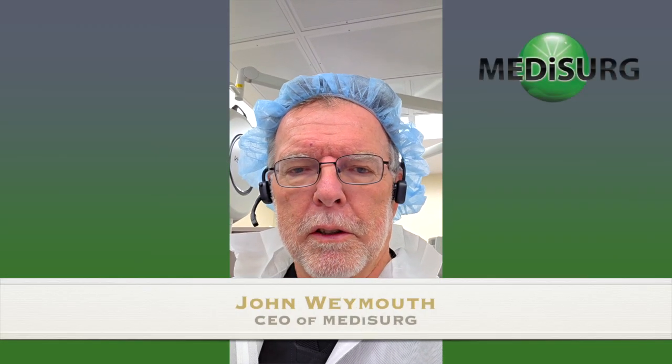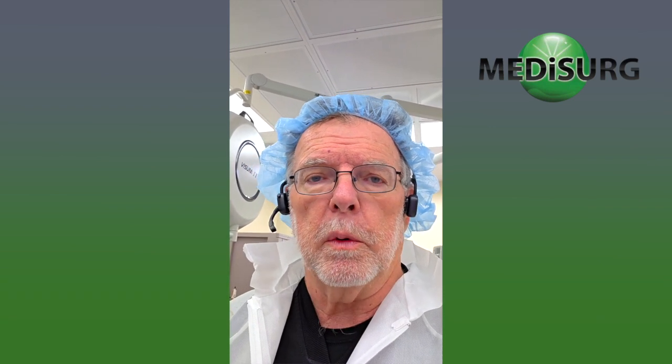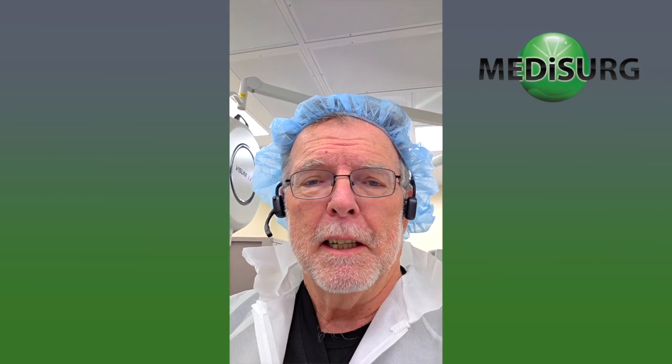Hi, John Weymouth here, doing some preventative maintenance on two Alcon Constellations. One's a 2014 unit and the other one is a 2024. Guess which one has the newest software? Take a look at this.